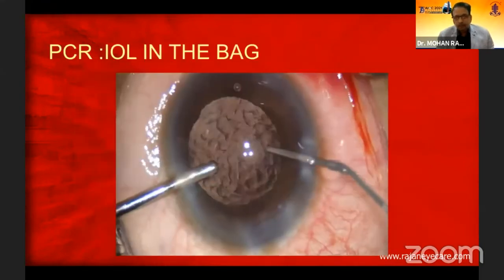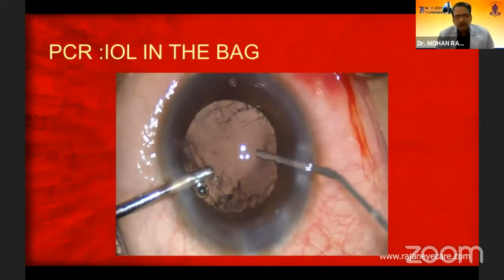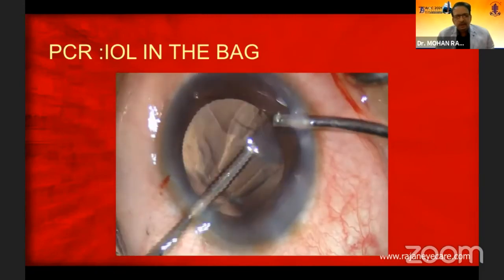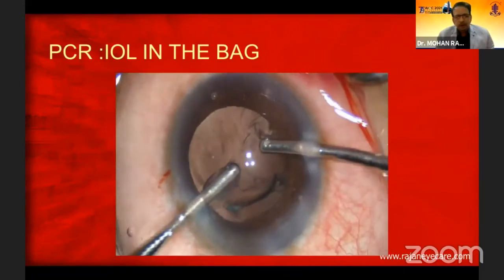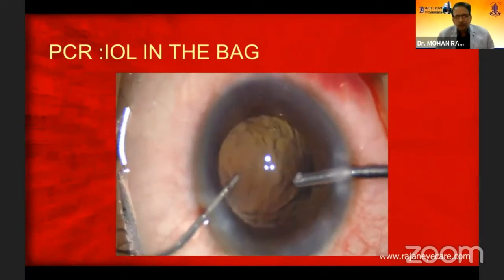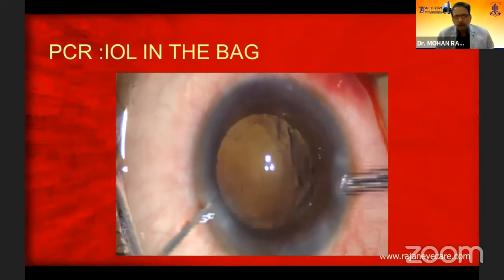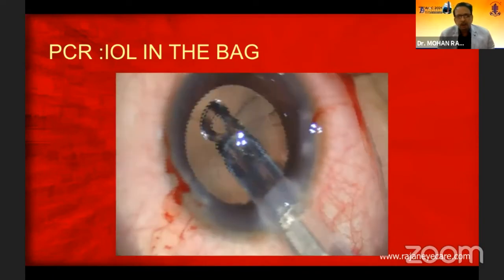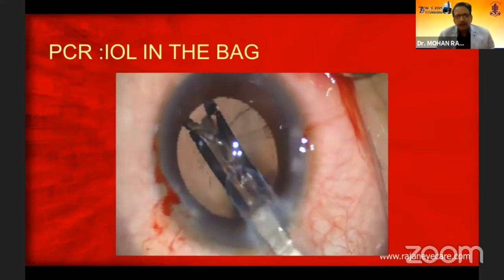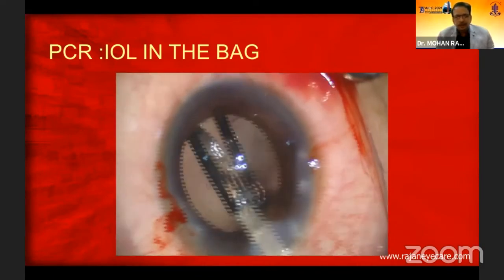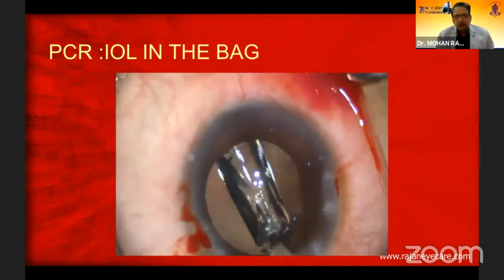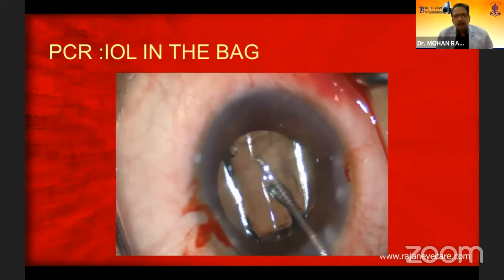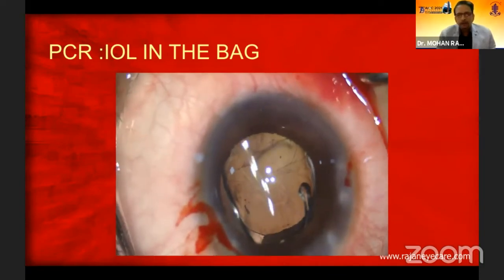Once you remove the vitreous and then the cortex as well — always remove the vitreous first and then the cortex. Always use bimanual techniques and inject viscoat, Viscoat, or Healon, or whatever viscosurgical device you have. When you come out of the eye, stabilize the anterior chamber. This is a very small PC tear — I'm putting a single-piece AcrySof lens into the bag because I know it is a small PC tear. It will not extend and the patient is doing very well.